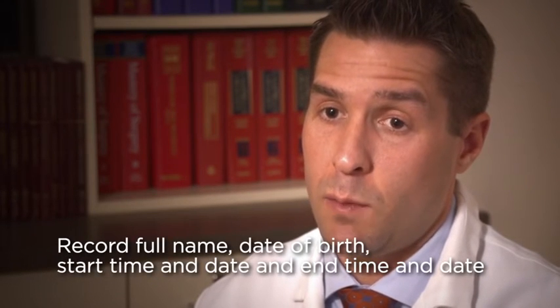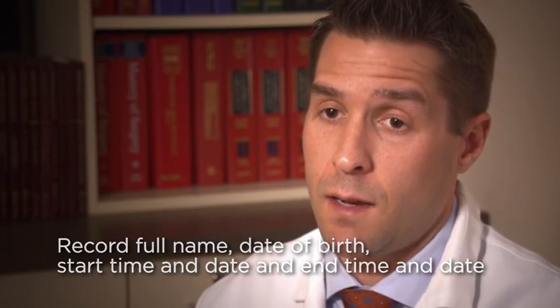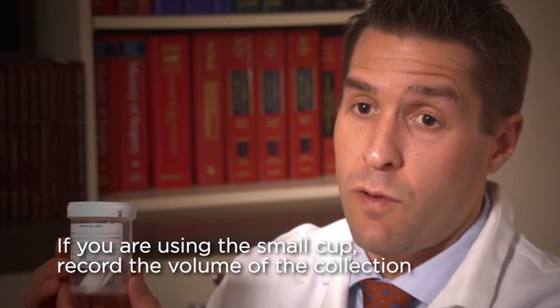It's very important that you write your full name, date of birth, start date and start time, end date and end time, and for the small collection container, you must write the full volume of the collection on this container.